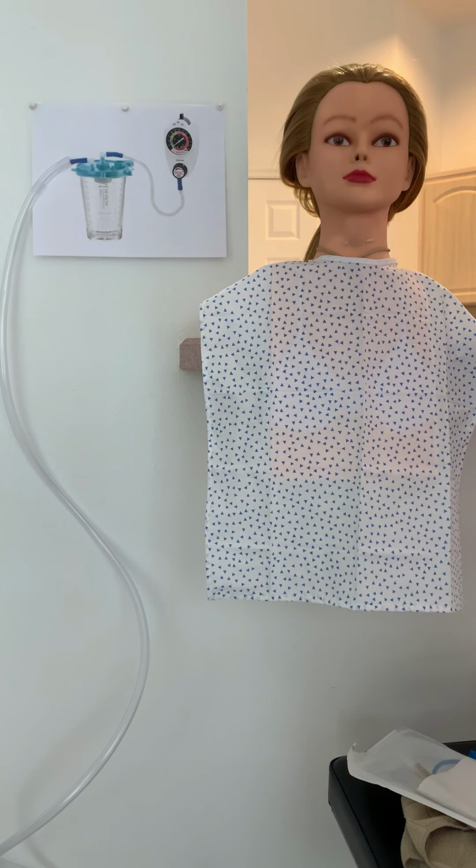So I'm going to provide for privacy. I'll shut the door to the room and possibly shut the curtains if necessary. Next, I'm going to get the bed in the proper position. So I'm going to raise the bed up to a good working height. I'm going to put the side rail down on my side of the bed and make sure it's up on the opposite side. And then I'm going to position the patient in a high Fowler's position, so at least a 45-degree angle. And I can add additional pillows behind her if needed.